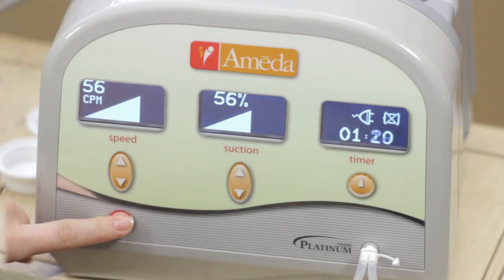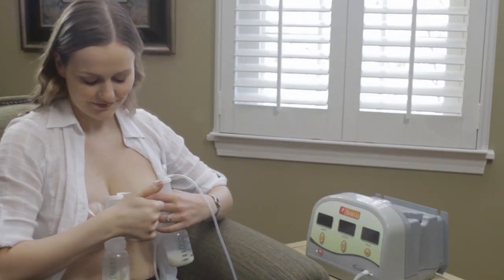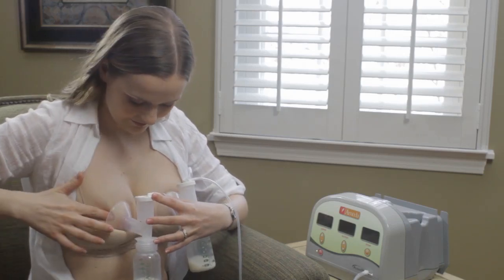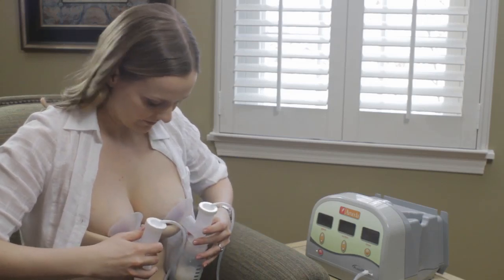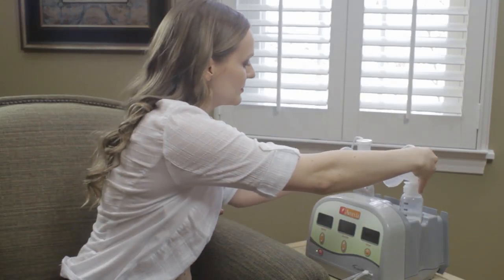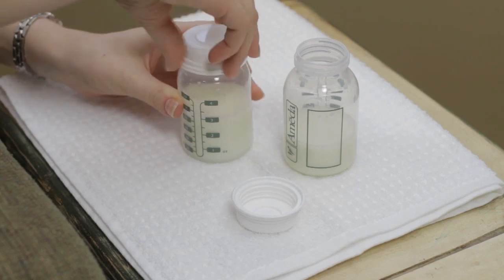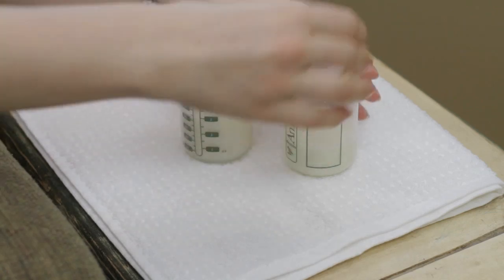When you finish pumping, turn off the pump by pressing the power button. Then remove the flanges from your breasts. If necessary, break the suction by inserting a finger between the flange and your breast. When the suction is broken, remove the flange. The pump's built-in bottle holders can securely support any size milk container or storage bag. Finally, unscrew the bottles and screw the locking caps into place. Follow the milk storage guidelines you're given.